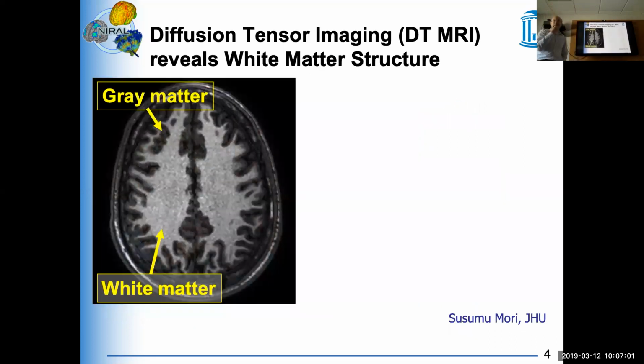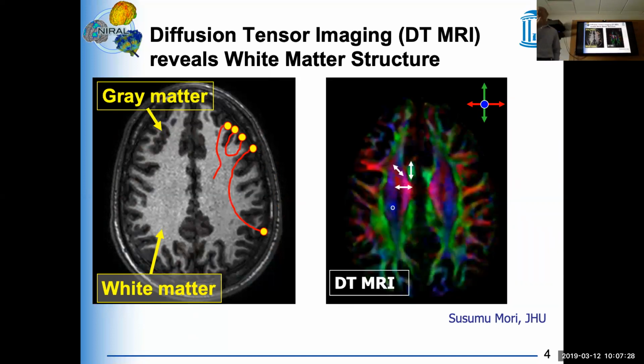Now, standard MRI does not really help us to look at such fibers. I mean, we can see the white matter. This is a T1 weighted image. You can see the gray matter is gray, the white matter is white, but I don't really see on this how things are connected or how fiber tracks run. So we would like to see something more similar to this, where we see locally how the tracks look. And that's where diffusion imaging comes in.